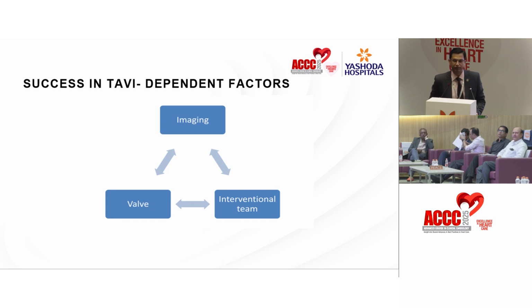Because TAVI we don't do just for high-risk cases, now we are doing it even for low-risk patients whom maybe 10 years back you would be doing an open heart surgery instead of TAVI. So for that purpose, imaging is very important, so is the valve and the interventional team.